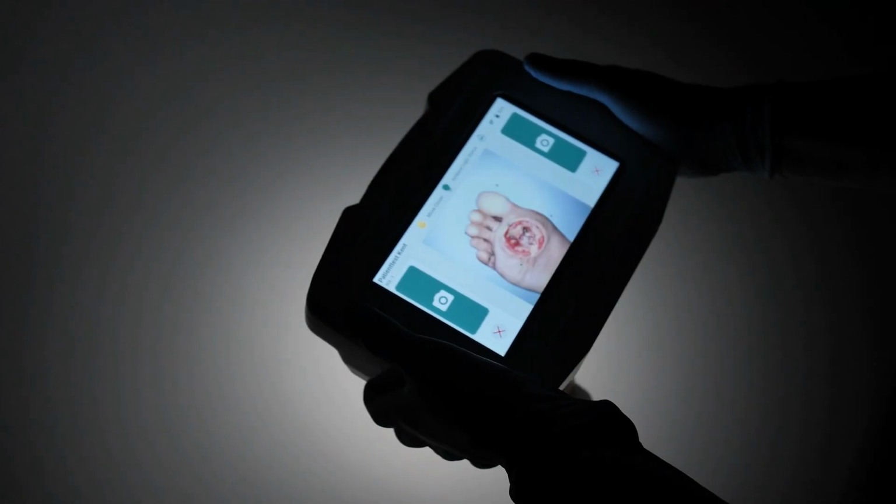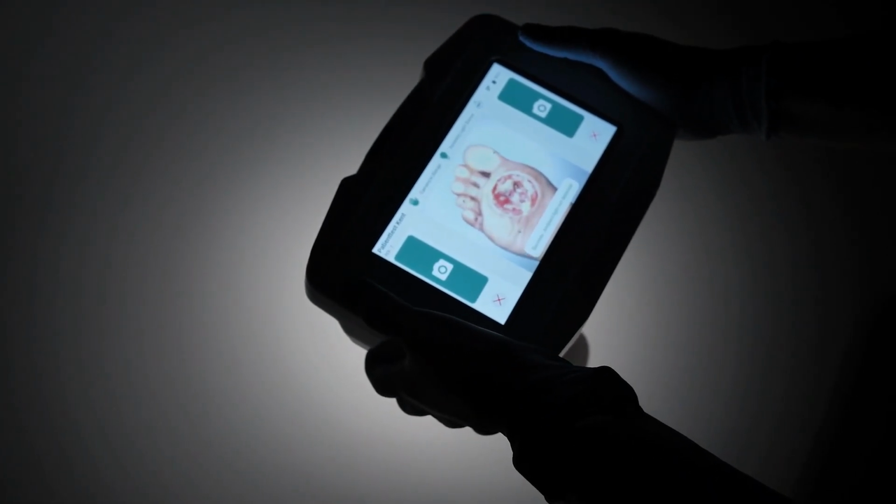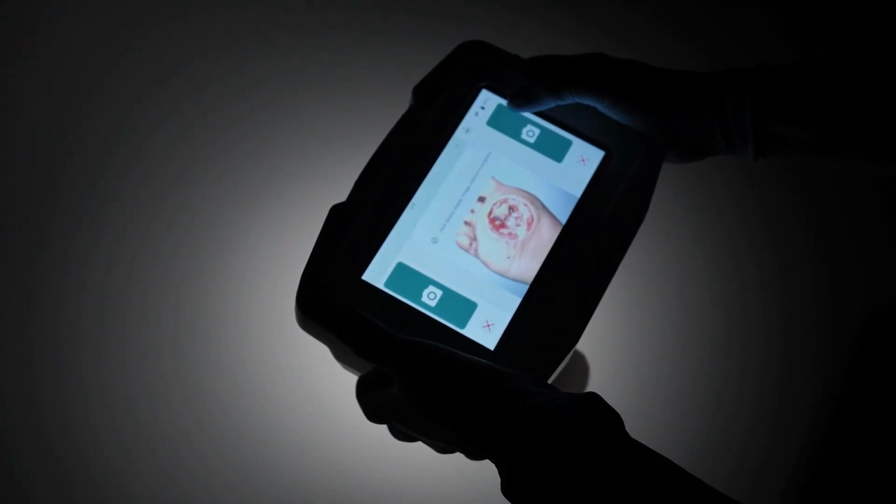Take an image in 3 simple steps. Step 1. Prepare the room by turning out the lights or using the SnapshotGLO drape. Step 2. Use the indicators on the device to confirm light status and distance from the patient. Step 3. Take the picture. The device will process the information, and you will see both the clinical image and bacteria image results side by side on the screen.